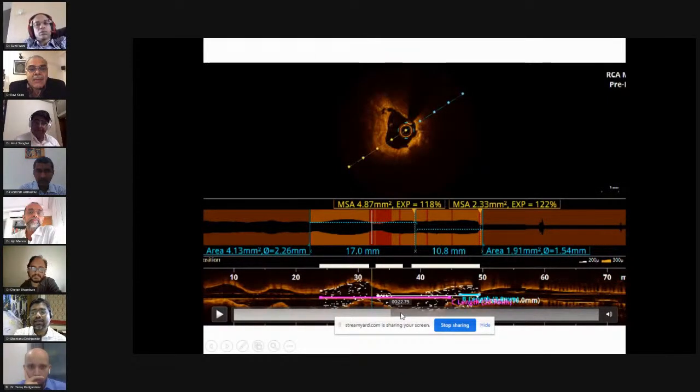Little height. Okay. Yeah, here the stent is not seen actually, and then again stent is seen. Then again stent is not seen. Okay, you can go ahead.